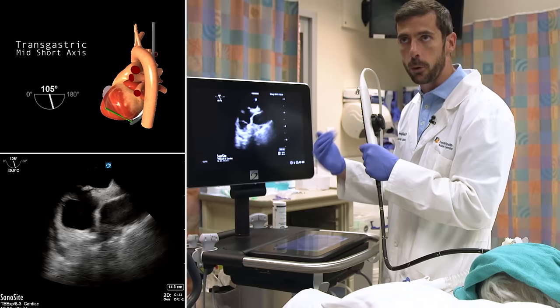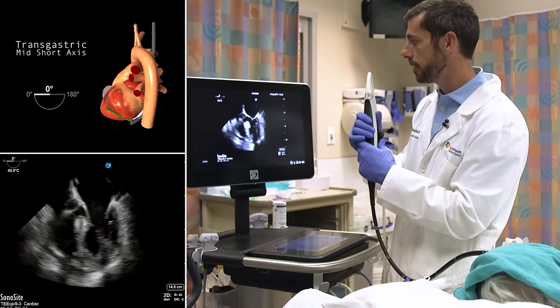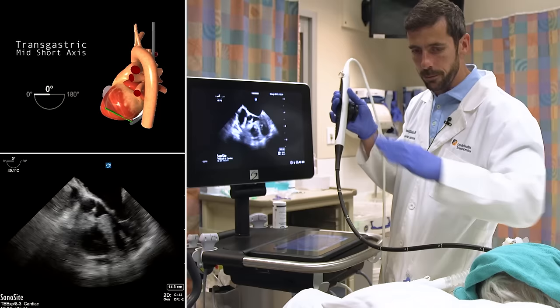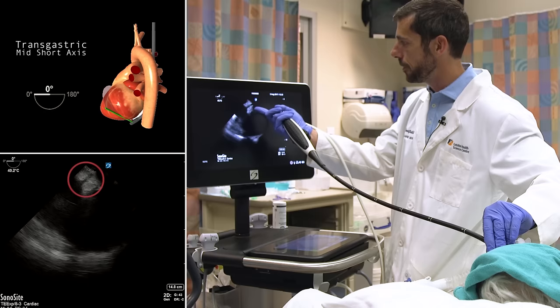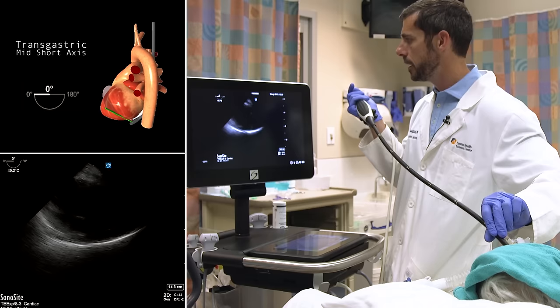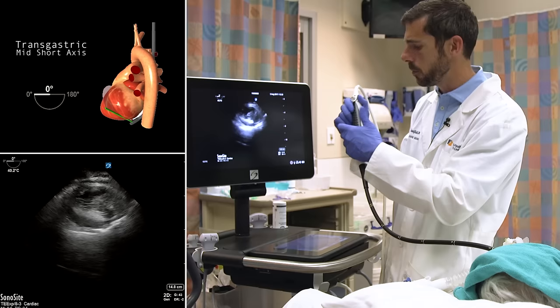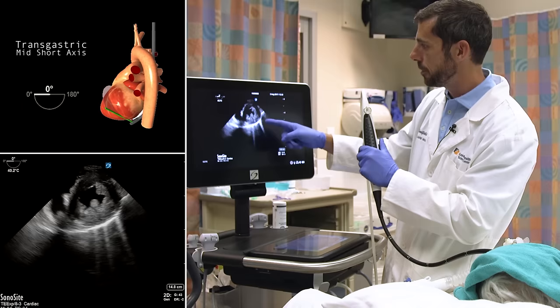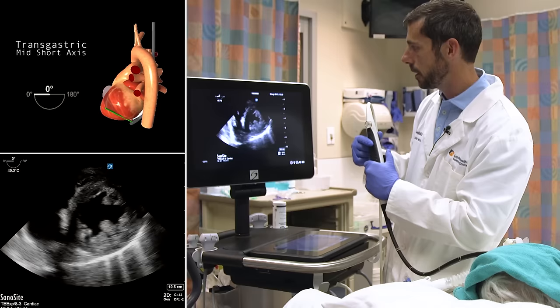From the bicaval view, I'll complete the fourth view of the goal-directed echo by going into the stomach. I put the multiplane crystals back to zero degrees. I'm now in the mid-esophageal five-chamber view — this is the view to return to if you ever get lost in TEE. I ensure the probe is neutral and the large wheels are not flexed, then advance into the stomach. Passing by the coronary sinus and the GE junction, I advance until I see liver or rugae in the near field. I then use the large wheel with clockwise rotation to introduce anteflexion, bringing out the mid-level of the left ventricle. Decreasing depth, the papillary muscles come into view — the ideal view for assessing LV function in short axis.